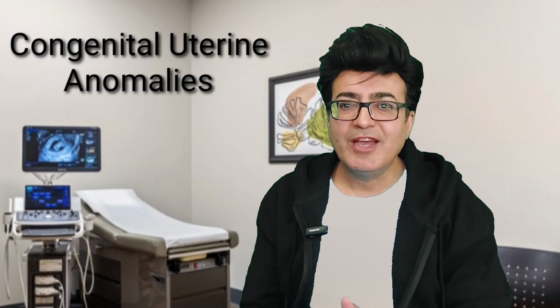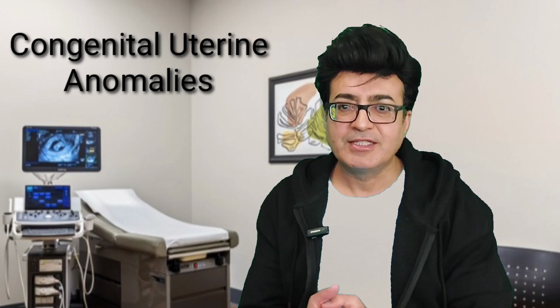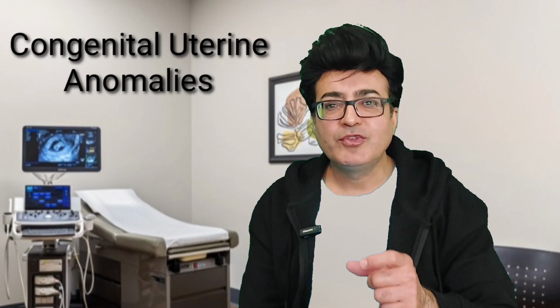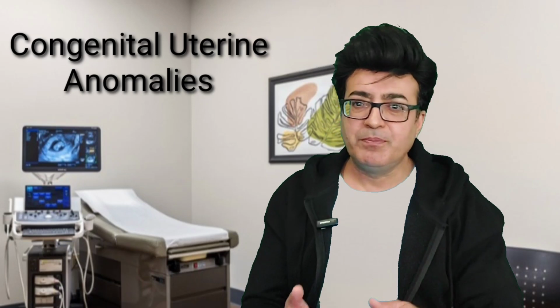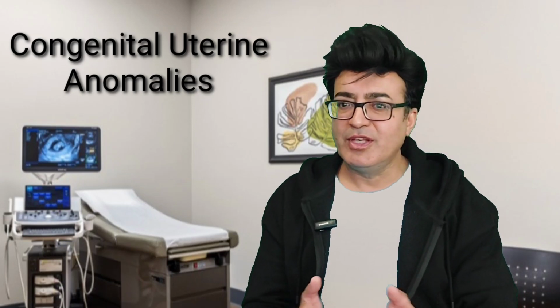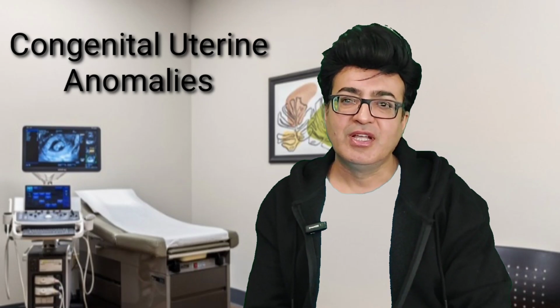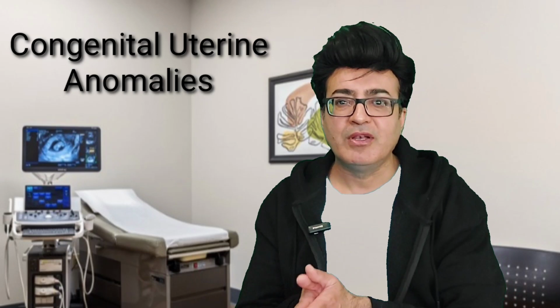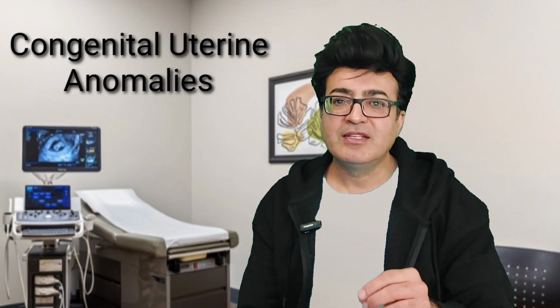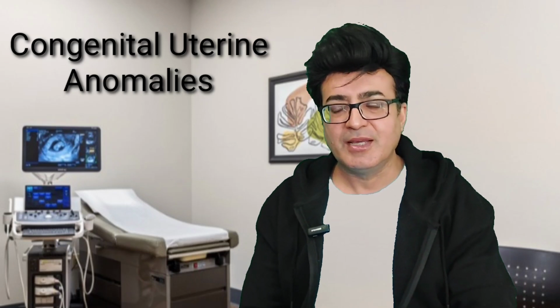When you come across congenital uterine abnormalities, you have to keep three important points in your mind. Number one, you have to take the thickness of the fundal region. Keep practicing this regularly. When you come across a normal uterus, take the thickness of the fundal region time and again. So whenever you come across an abnormal fundal thickness, this will start ringing a bell in your mind and you will definitely think of congenital abnormalities.